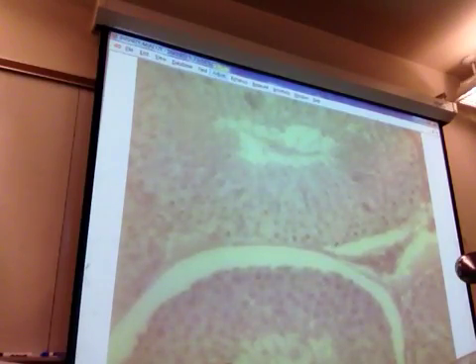So if you have a nurse cell down here, the basal layer would be like these cells down here, and the luminal would be more up here. It's the spermatogonia versus the primary and secondary spermatocytes and the spermatids. So the nurse cell and the spermatogonia make up the basal layer, and everything else makes up the luminal layer. Pretty much, yeah. They've got a nice textbook diagram of it.